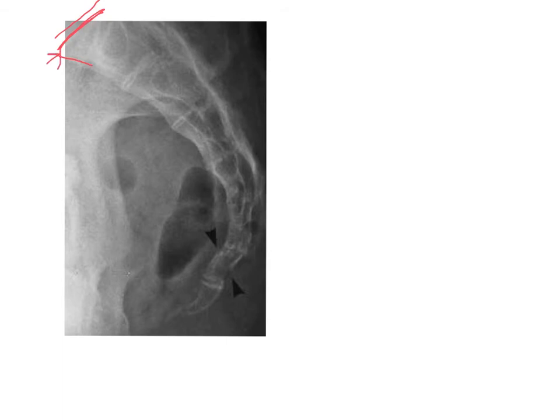We've also cut off the top part of our sacrum, which would demonstrate the sacral promontory. And this area here is the sacral base. Looking more towards the posterior of the sacrum, we are looking at the median sacral crest. And remember, the sacrum has a convex curvature to it. It's shovel-shaped, so it turns around this way. You're seeing some arrows down here. This is indicative of a fractured tailbone, which is one reason why we would do this projection.